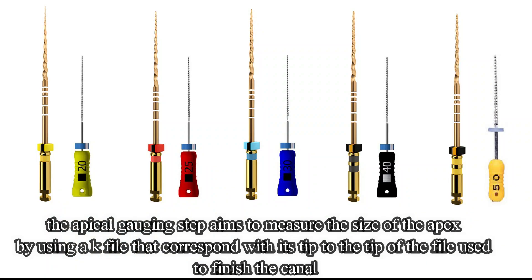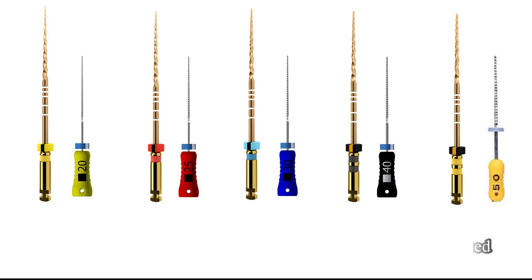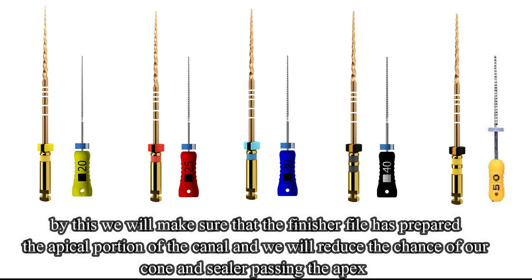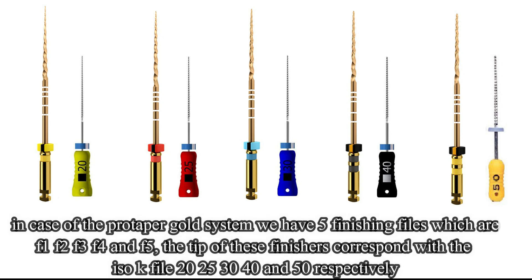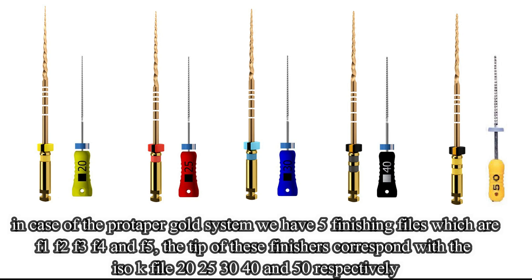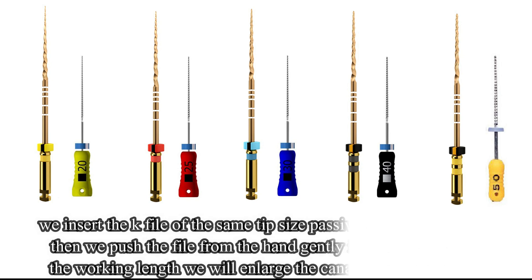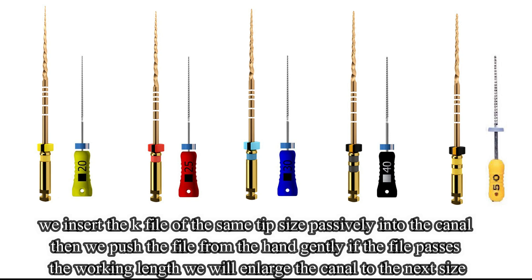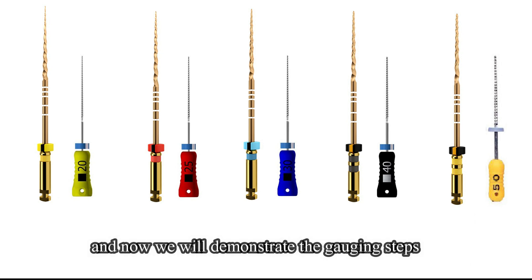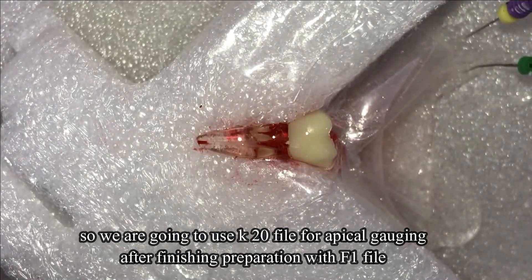The apical gauging step aims to measure the size of the apex by using a K file whose tip corresponds with the tip of the file used to finish the canal. By this, we will make sure that our finisher file has prepared the apical portion of the canal and we will reduce the chance of our cone or sealer passing the apex. In the ProTaper system, we have five finishers from F1 to F5. The tips of these finishers correspond with ISO K files 20, 25, 30, 40, and 50. After finishing with each finisher, we gauge the canal with the K file of the same tip size. We insert the K file passively into the canal, then push the file from the handle gently. If the file passes the working length, we will enlarge the canal to the next size. Now we will demonstrate the gauging step — we will use a K20 file for apical gauging after finishing preparation with the F1 file. We will measure the file to our working length, which is 21 mm.